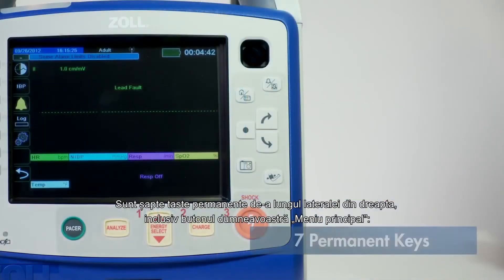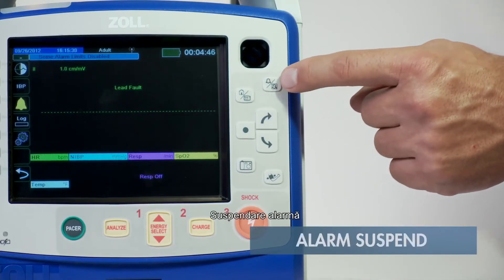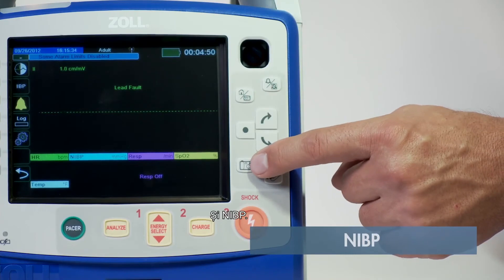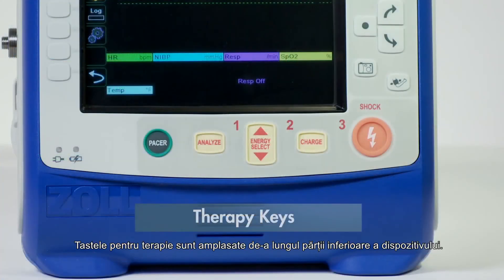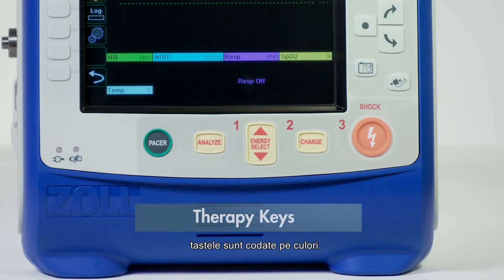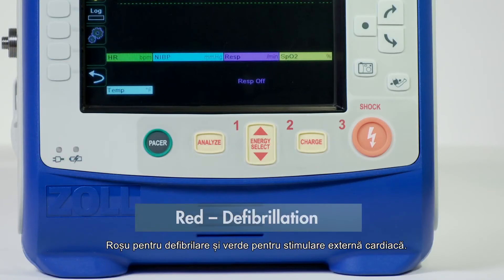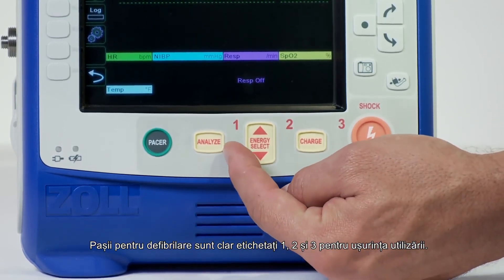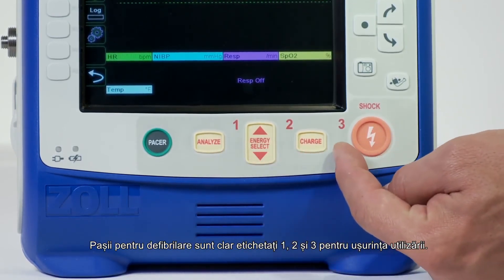There are seven permanent keys along the right side, including your home button, alarm suspend, primary navigation keys, snapshot, and NIBP button. The therapy keys are located along the bottom of the device. Similar to other devices, the keys are color coded — red for defibrillation and green for pacing. The steps for defibrillation are clearly labeled 1, 2, and 3 for ease of use.